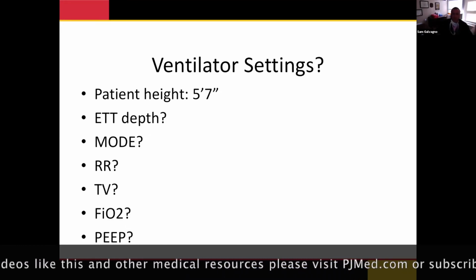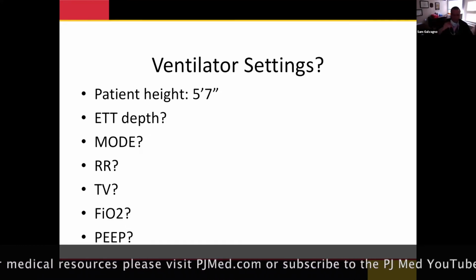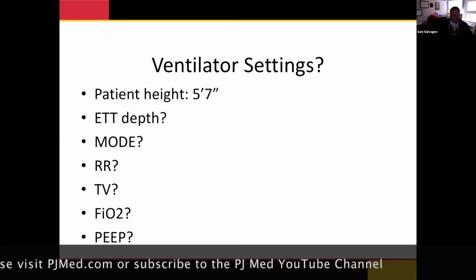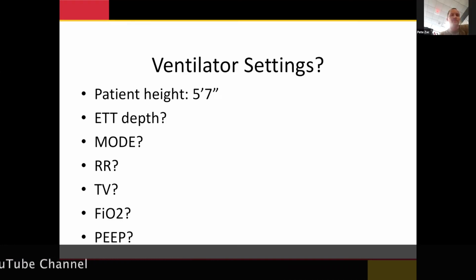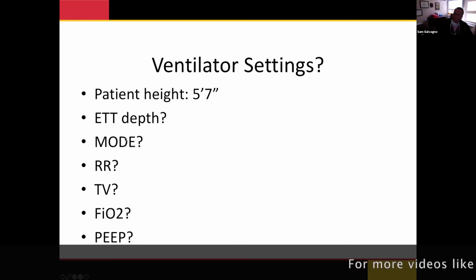Good. What respiratory rate? Anything you want to pick on that? 20. Any thoughts? Okay, fair enough. So we got our tidal volume. What mode are you going to use?